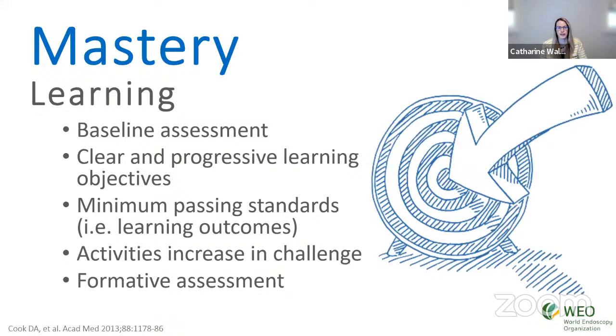Another simulation strategy that's been deemed beneficial is mastery learning, and it refers to the ability to consistently demonstrate a predefined level of proficiency. So you're meeting a mark before you move on to the next task. And we're going to learn a lot more about this in the second half of the talk, so I'm not going to go into it in depth.